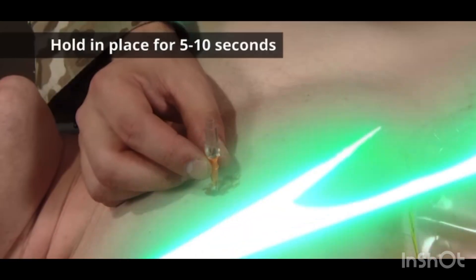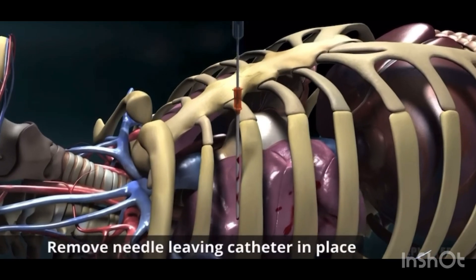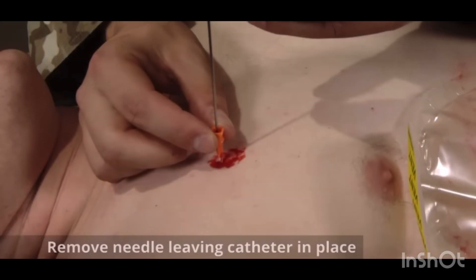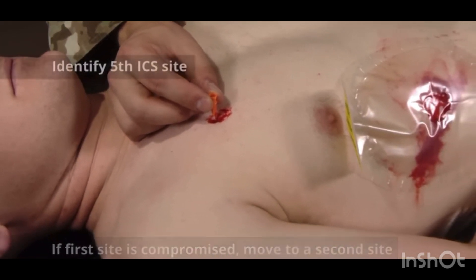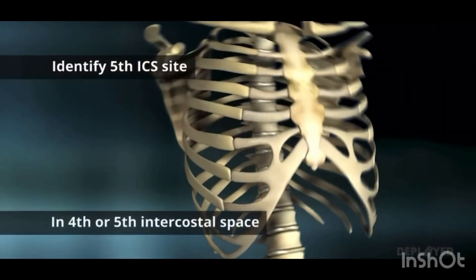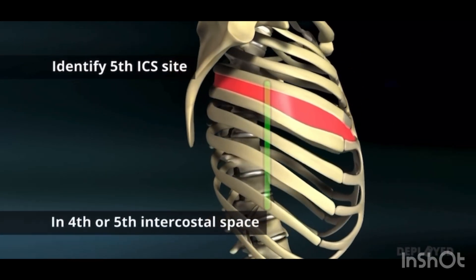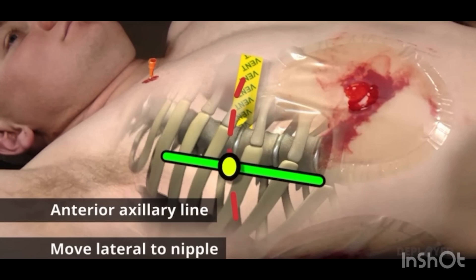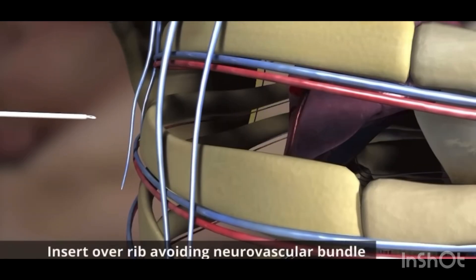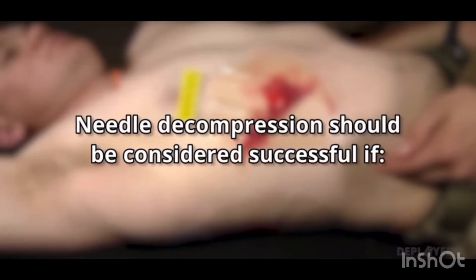Step 3: Once entered into the location, hold it in place and allow air to decompress. You should hear a hissing sound, then remove the needle and place it in the sharps bin. Alternatively, if unable to access the second intercostal space, you can go into the fifth intercostal space, mid to anterior axillary line, above the sixth rib. We enter the needle above the third or sixth rib to avoid any neurovascular bundles or major blood vessels.